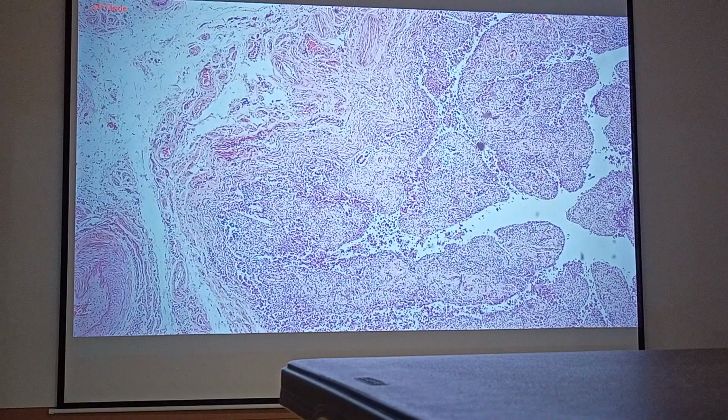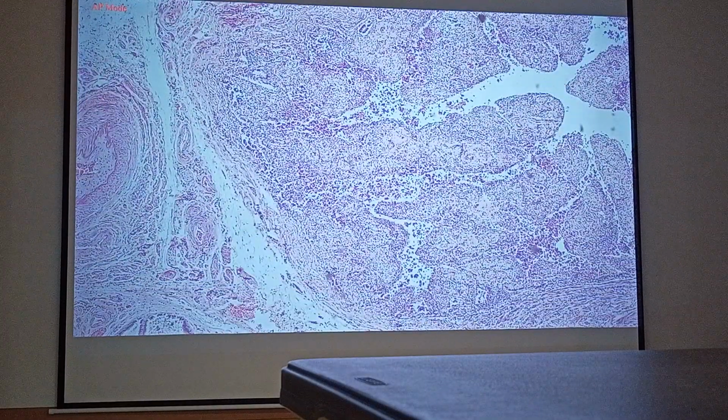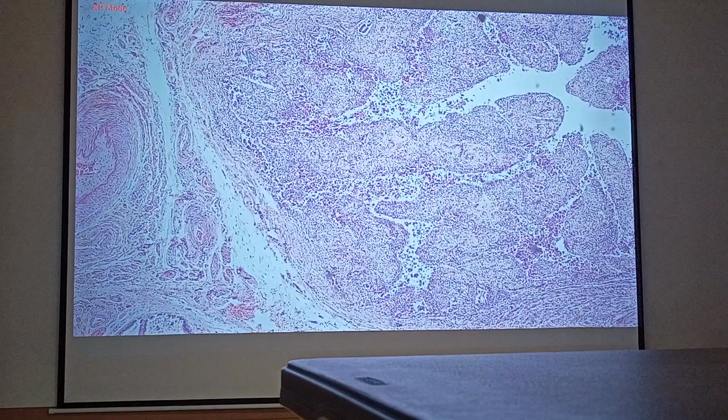Okay, so aside from the necrotic epithelial cells, the detached necrotic epithelial cells are actually accompanied by neutrophils. And this again is the microscopic appearance of pus. This will be dripping towards the endometrial cavity of the uterus, which will also eventually go out to the cervix.